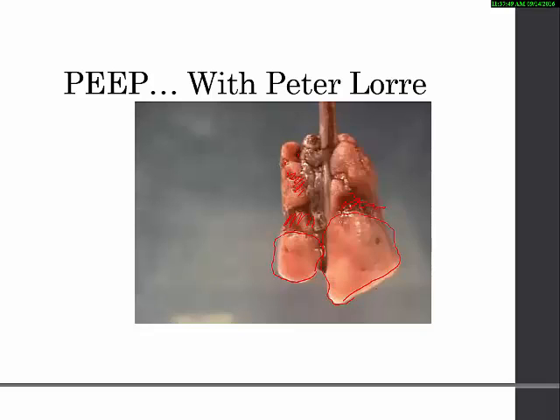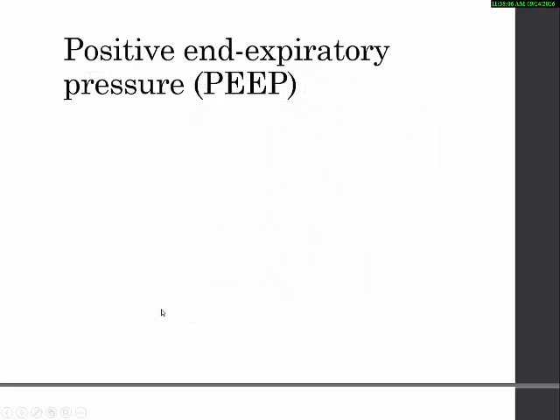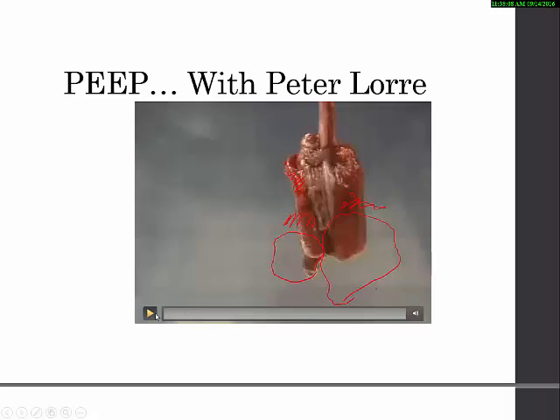All right, so this has not been a full inflation of the lung, which means all those areas I just indicated are not going to be doing gas exchange. This is bad for a patient because you're not getting the full capacity of the lung working. And what you'll see is that this doctor is going to then put PEEP on, and when he puts that on, you're going to see that the lungs will inflate more fully.